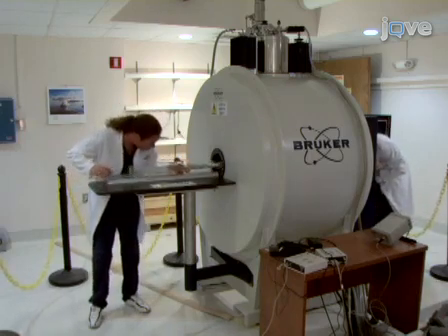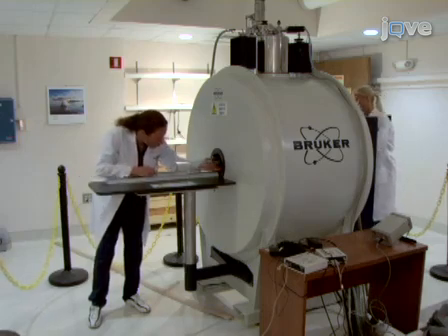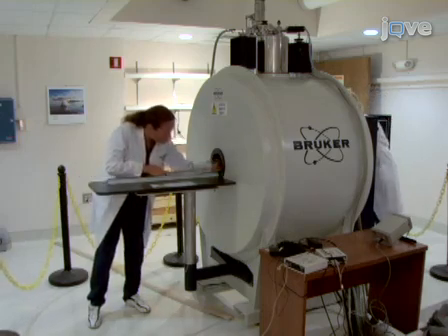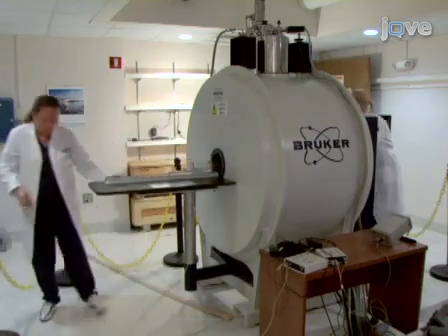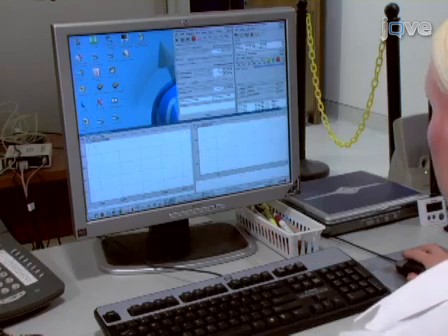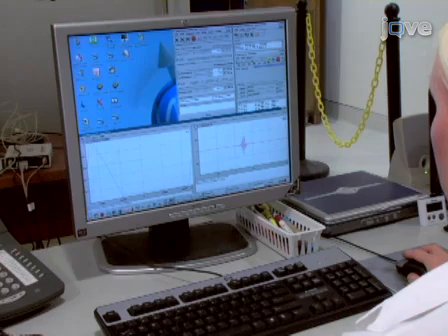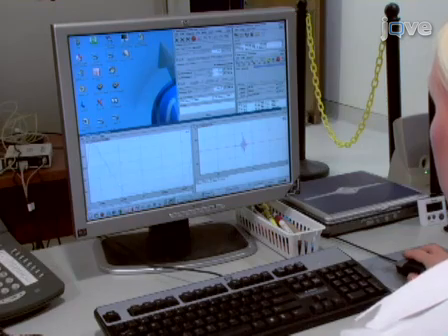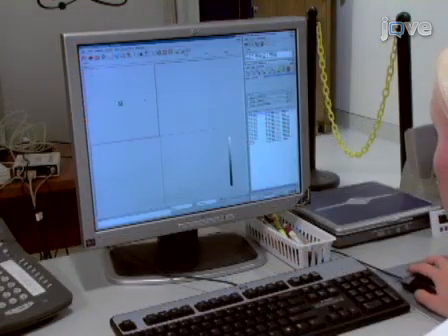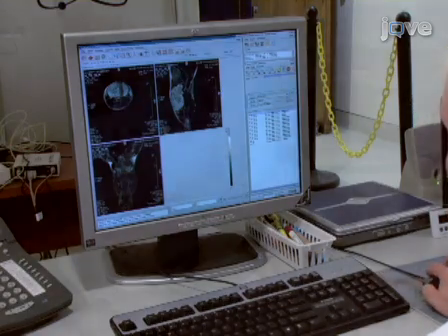An actively decoupled 72mm resonator is used to transmit RF energy to create the signal, while the head coil is used for signal reception. Now determine the initial position using a real-time one-dimensional readout in the caudal rostral direction. Use of surface coil reception restricts signal to the area around the surface coil, limiting the need for interpretation of the observed waveforms. Then, acquire a 3-plane localizer to determine the precise position of the animal in the scanner.